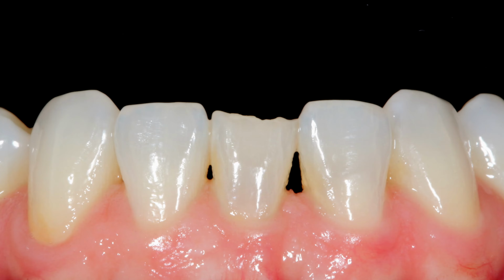So Dr. Corey, this is a case that you sent in. I mean, the ink couldn't have dried on the new kit yet, and you had sent this case in already. Why don't you talk us through it a little bit? It looks like maybe the patient was a little older. I'm not exactly sure what happened in this situation, but if I recall, she chipped the tooth when she was younger. They repaired it, it kept breaking, and we just weren't having a whole lot of success with it.